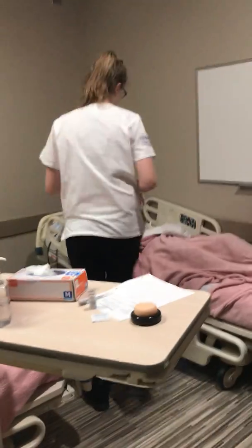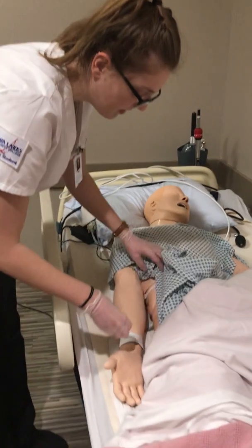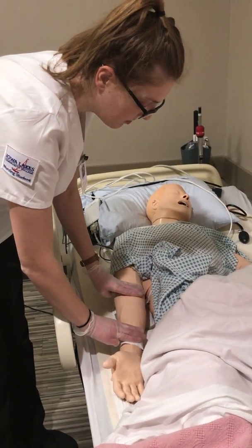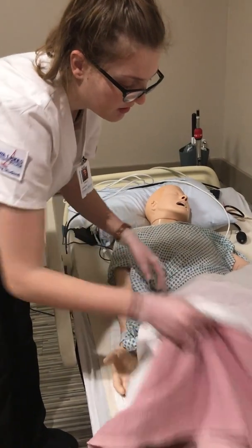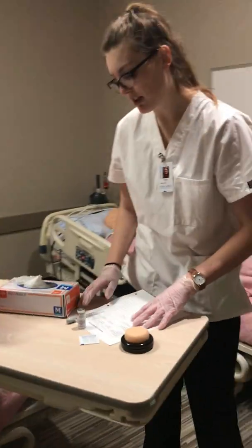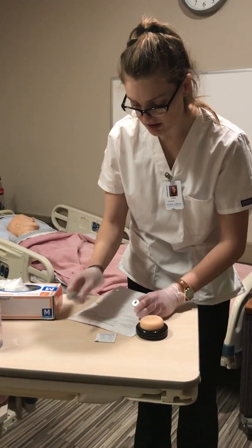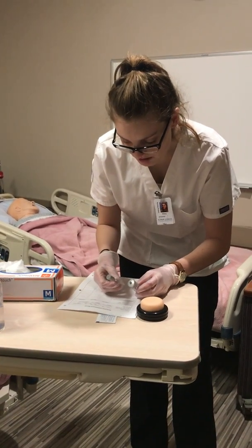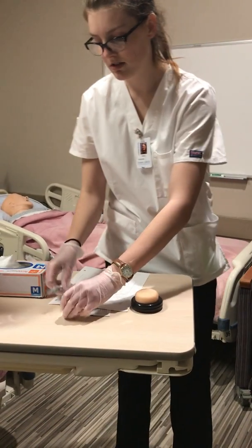The spot that I'm going to be doing this injection would be on the patient's arm. It would be 3 fingers above the radial pulse and 3 fingers below the antecubital space, so it'd be in this relative area. Now that I'm at the patient's bedside, I'm going to do my third and final check against my medical record to make sure that everything's okay. So I have my medication and what's in my syringe. Everything looks good.